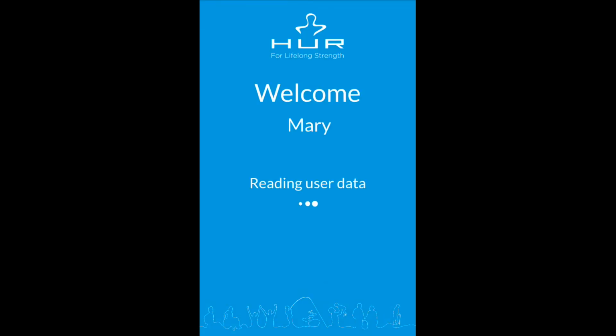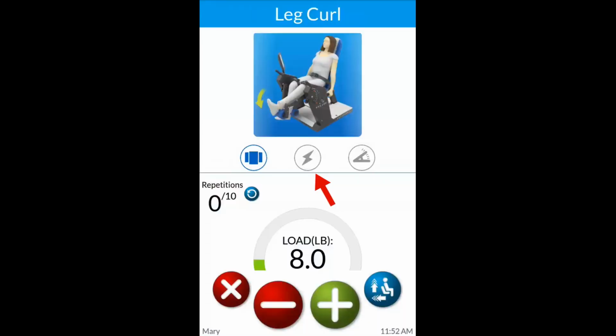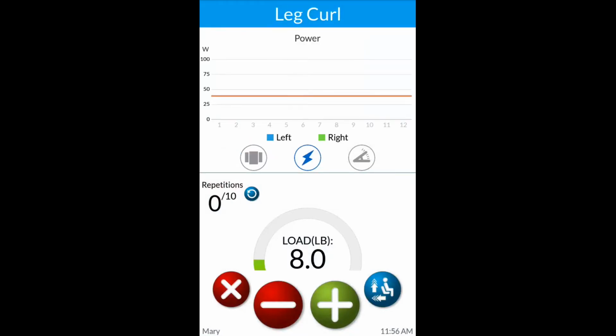The next time you log into the machine to work out, if you select the lightning bolt icon, a red line will show you what your target power is. Again, once you are finished, you will see the average power that was achieved for that workout.